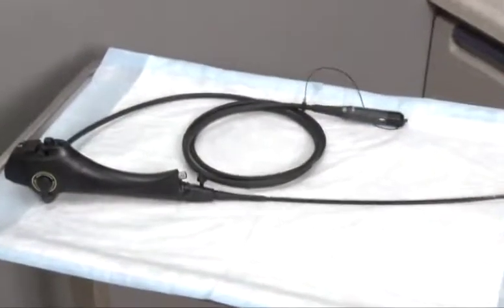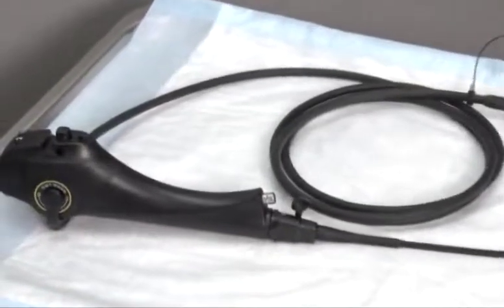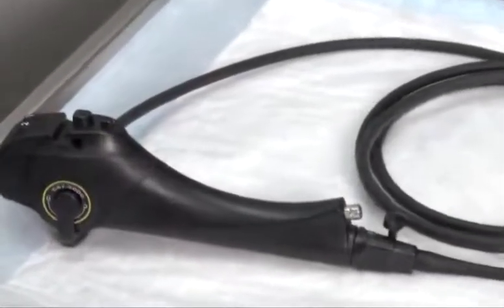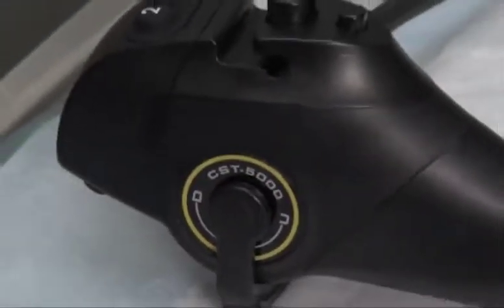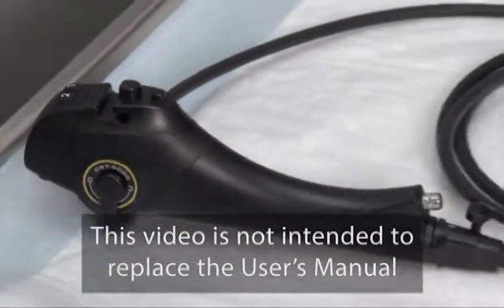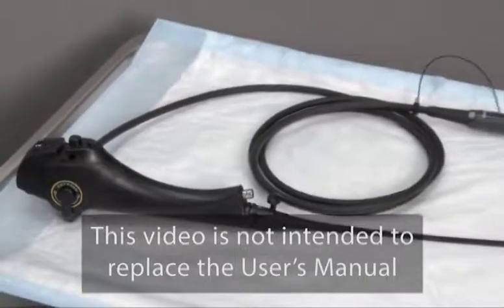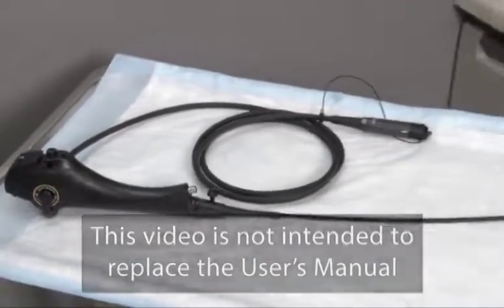The CST 5000 Cystoscopy System incorporates two essential components: the reusable D-shaped endoscope and the sterile disposable endosheath system. This video provides a step-by-step overview of the system's setup and use, but is not intended to replace the CST 5000 Owner's Manual, which provides greater detail on how to set up, use, and care for the system.